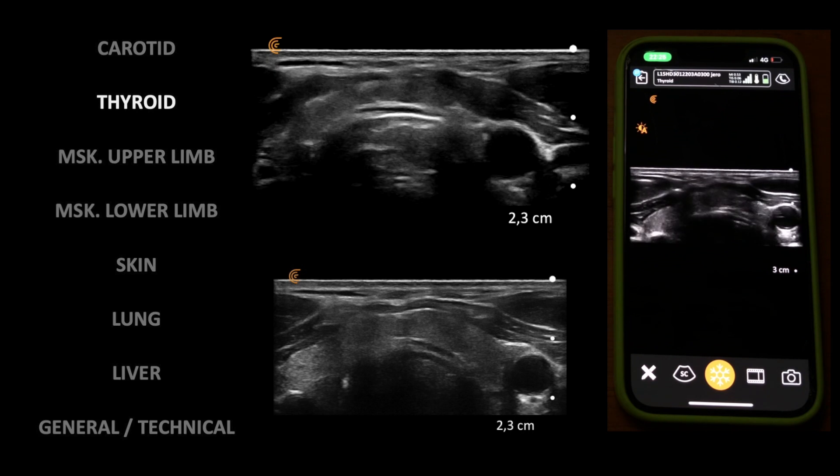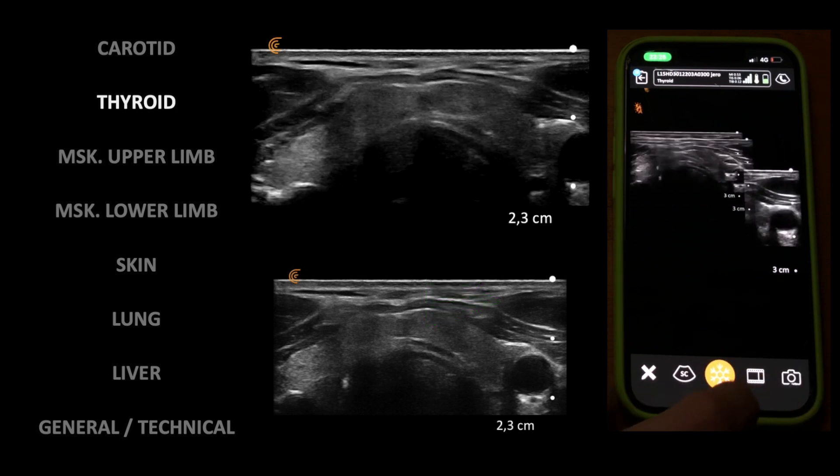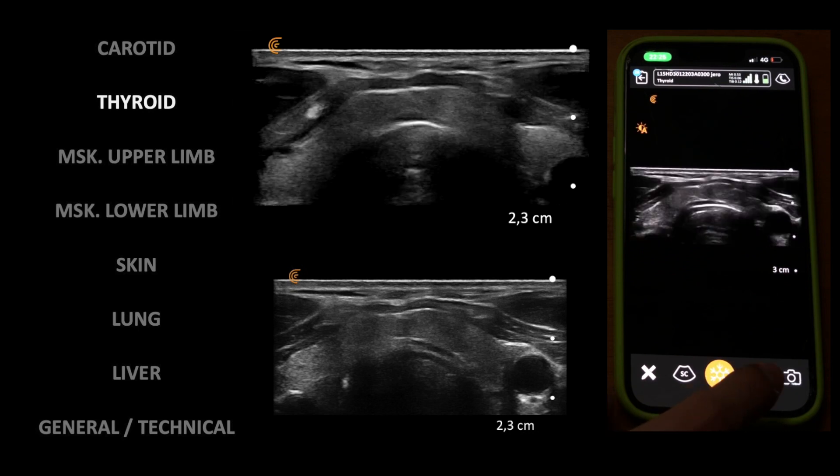Moving to the thyroid gland — this clip was recorded from the suprasternal notch. Note the probe footprint is quite large and can be tricky in thin individuals.